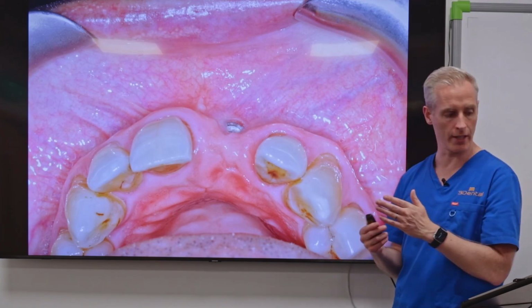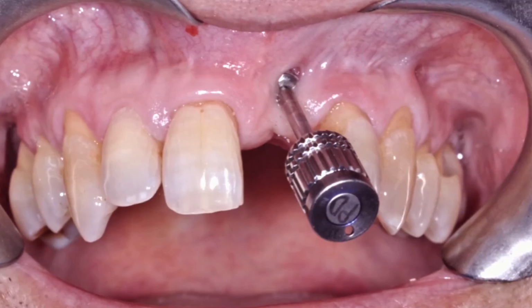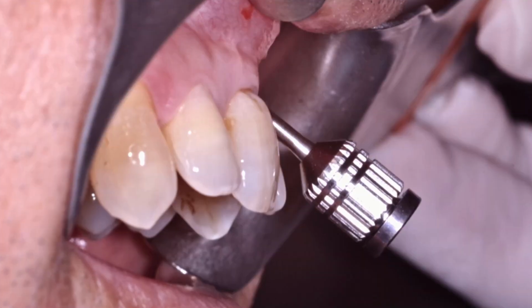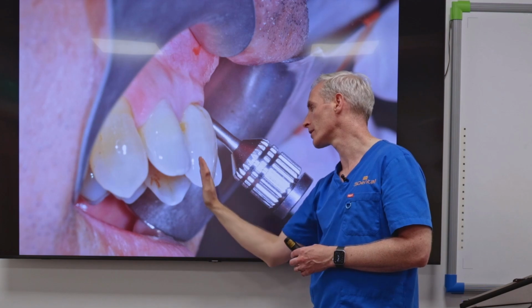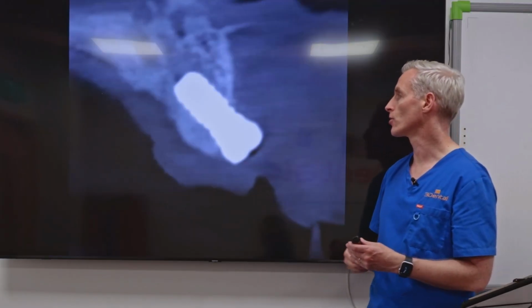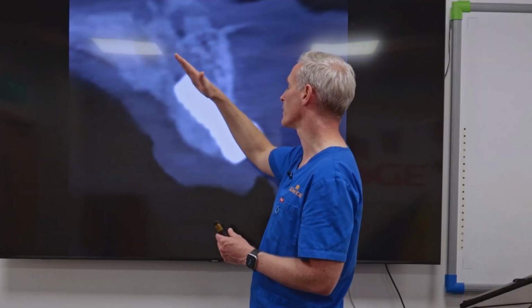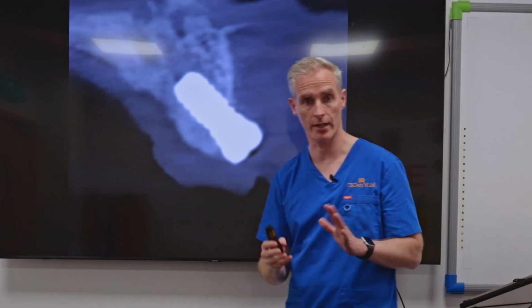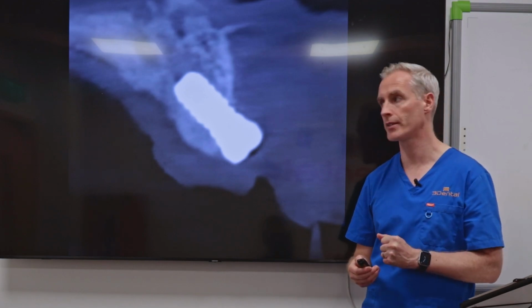Also, when I look at the trajectory of the implant, the way the implant is facing, you'll see here that the angulation of the implant is very much out through the front of the tooth, and it shouldn't be like that. It should be aligned with the rest of the teeth. And I've also taken a scan, this is a CT scan, that shows us the implant at that angulation, and this is the bone here. The implant should have been placed like this, but it was placed at an angulation that was incorrect. Unfortunately, there was nothing we could do here but take out the implant.